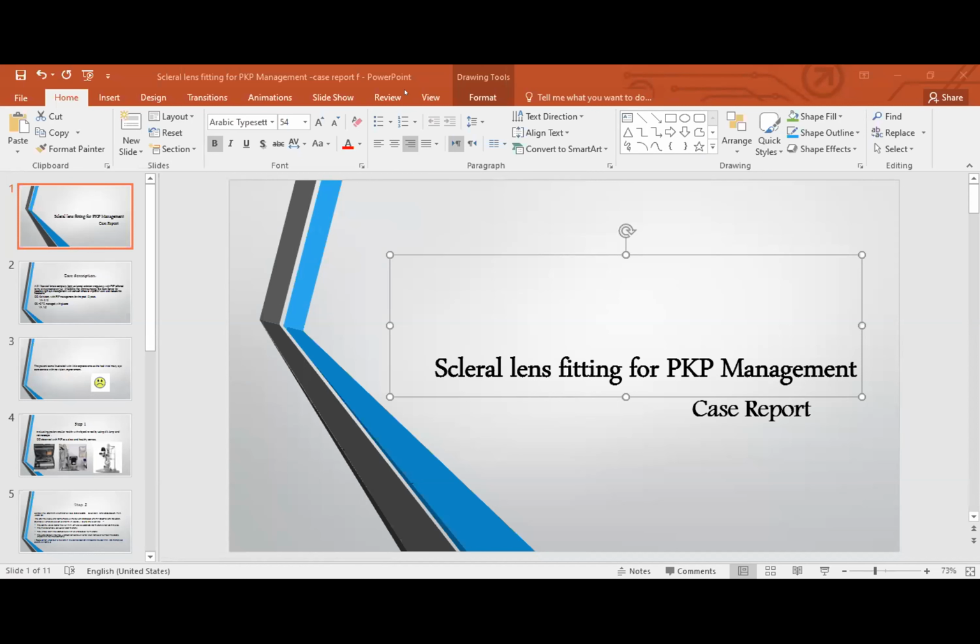Yeah, normal saline, not Versatile solution. So which one do you get in your country? The preservative-free or with preservatives? With preservatives. Okay, so he's asking if you can use normal saline with preservatives for scleral lenses.